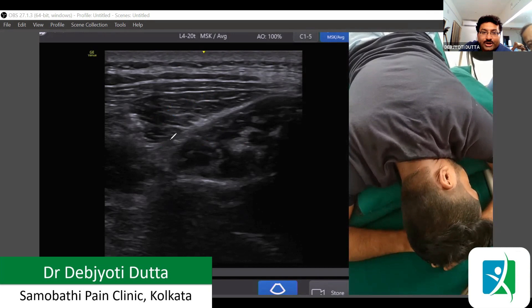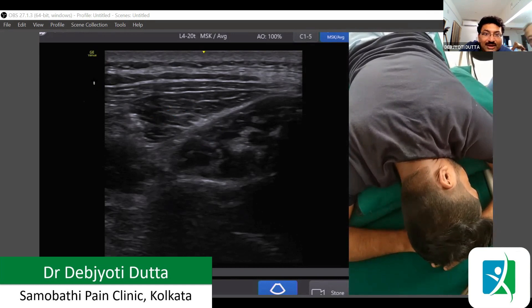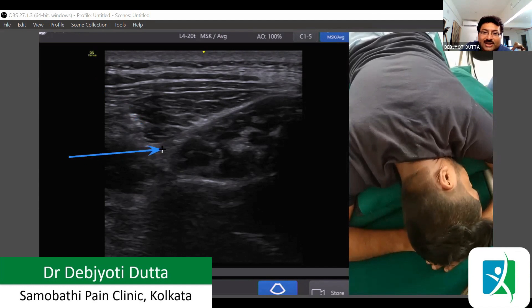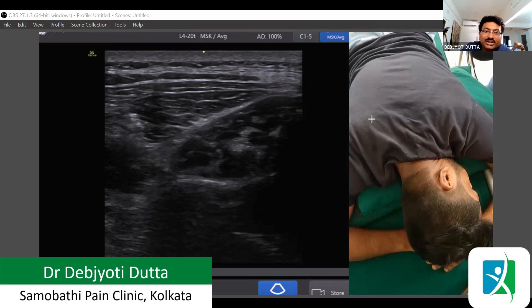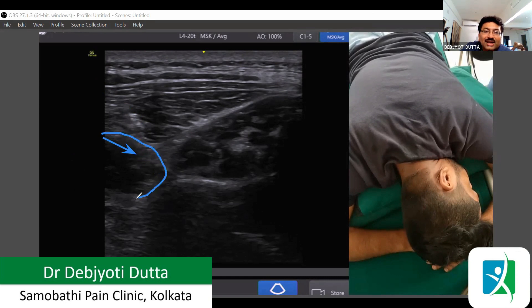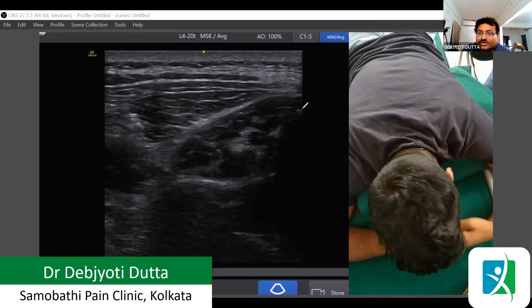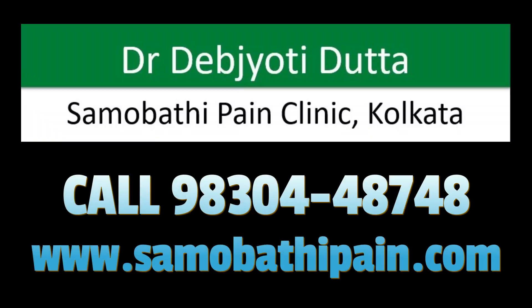To do the block, we need to come from the lateral side. Our needle trajectory will approach the nerve from the lateral aspect, and we inject local anesthetic and steroid around the greater occipital nerve. There is also another muscle visible here — the splenius capitis muscle. That is how we perform the ultrasound-guided greater occipital nerve block.